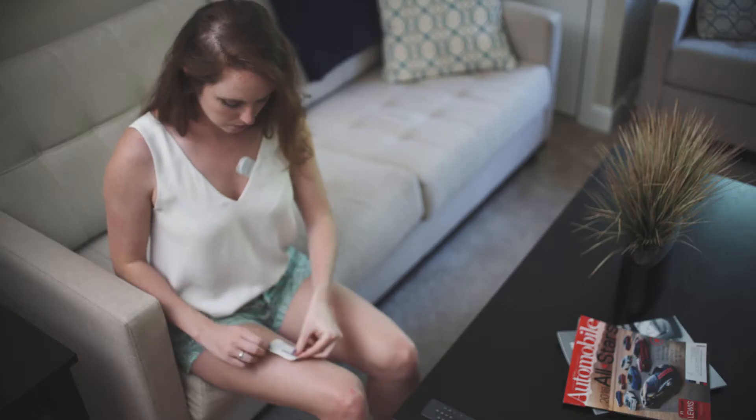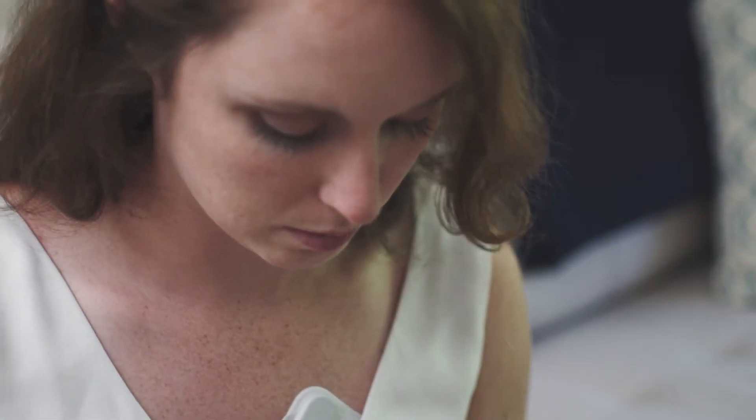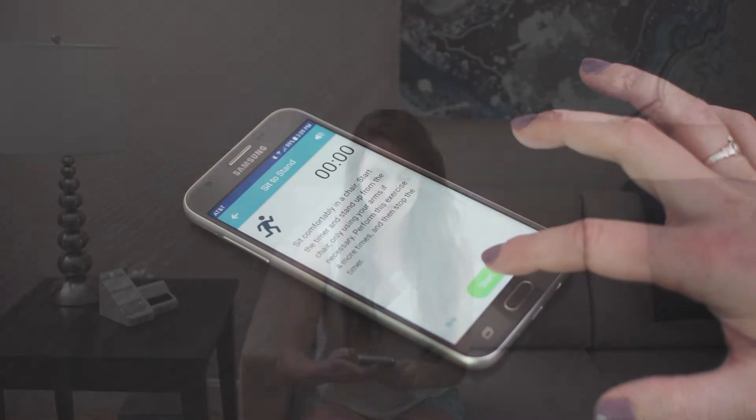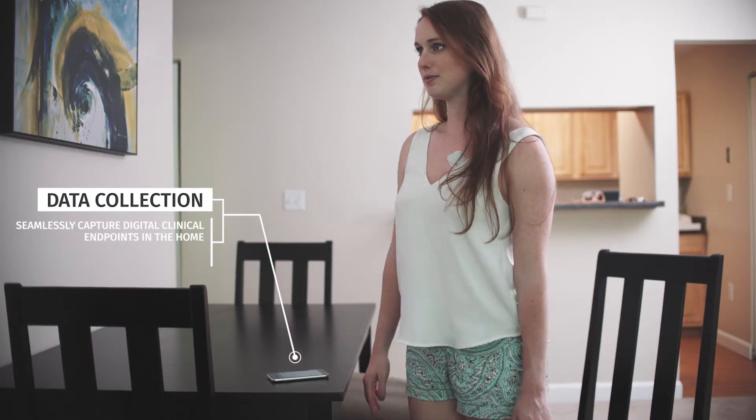The low-profile Biostamp sensors free subjects to comfortably continue with their daily routine without inhibiting their range of motion. Through the LinkApp, subjects can even be tasked to complete prescribed study activities and answer survey questions.